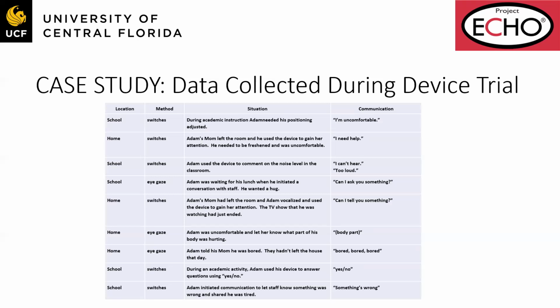And so when we looked at his access, it appeared eye gaze was not working very well for him. But when we did the evaluation, he did better with the new eye gaze camera on a different device. But we didn't want to go down exactly the same road anymore, so we also requested switches as well.